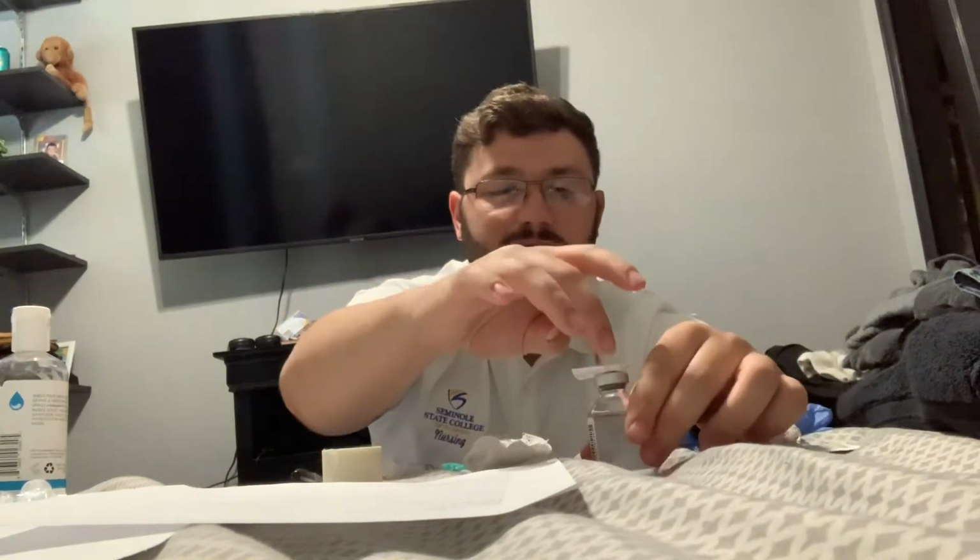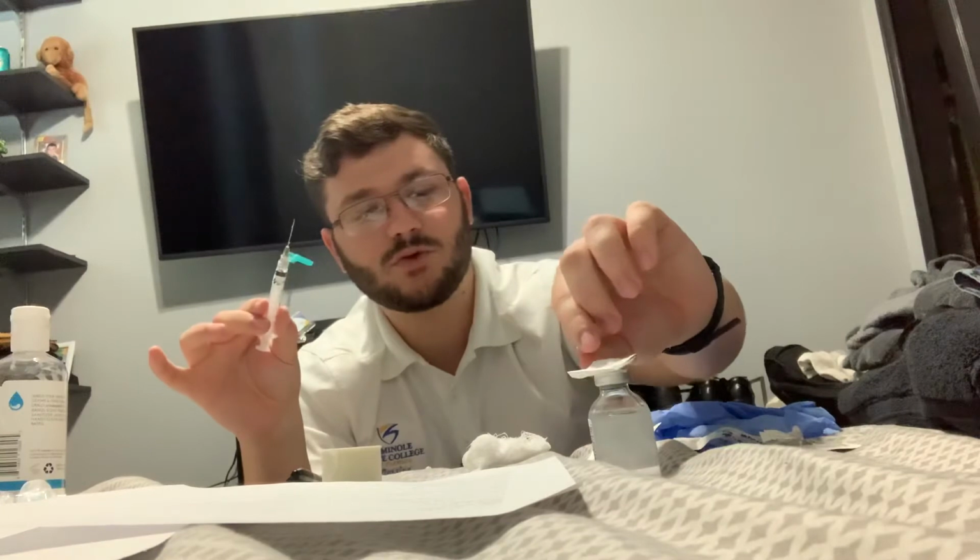Anyway, so I'm gonna rub the top of the vial for 30 seconds. So we will say that that is 30 seconds. I'm gonna leave this on the top to ensure that nothing contaminates with it. All right. So next up, I'm going to pull this apart with a rainbow method. Doing that ensures that I do not poke myself, or I do not contaminate the tip with any of this other surface. I'm gonna leave the cap on the end of the table so that if I have to recap, I can. I'm gonna remove the top prep alcohol pad.